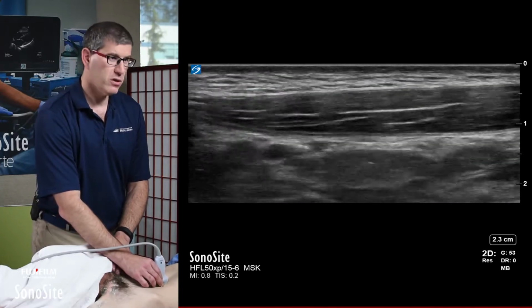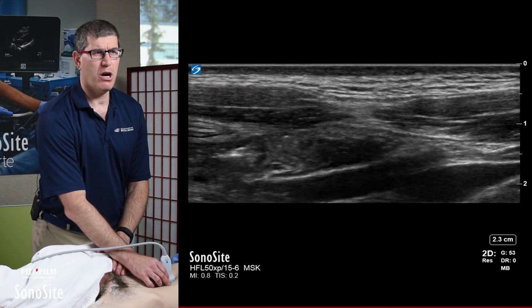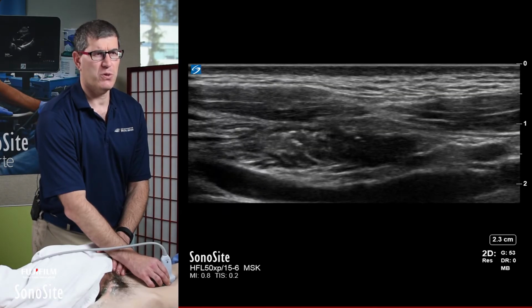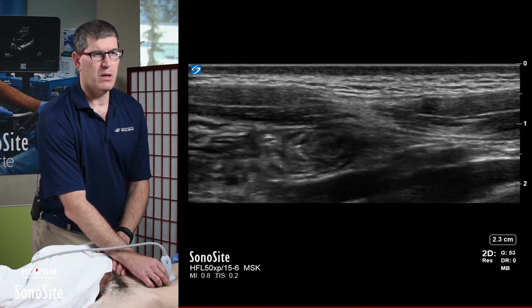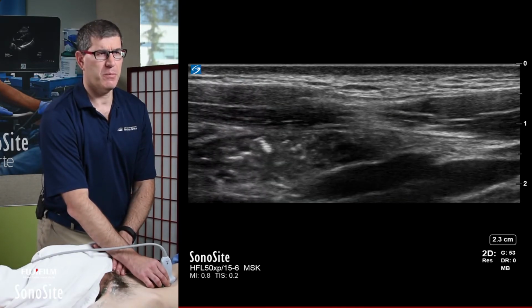As I continue to advance upward, you're going to start seeing the interdigitations of the rectus abdominis muscle. Right there, we can see that interdigitation, that hyperechoic area between two portions of the rectus abdominis. Now I'm going to take a little time here to just explore the rectus abdominis and ask the patient to do a little bit of an abdominal crunch.